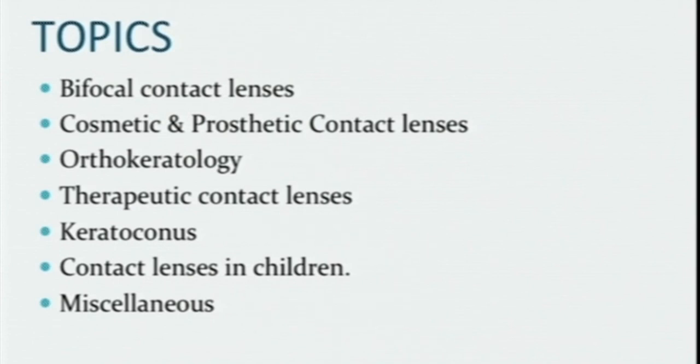And usually the pre-LASIK patients are better suited for the orthokeratology lenses. One advantage is that. The second advantage is it can be handled by the parents instead of the children. So the visual acuity is maintained throughout the day, and the next day, in fact, for some patients, once in 2 days they use their orthokeratology lenses.